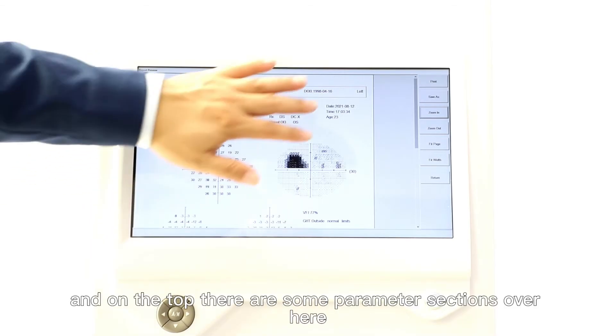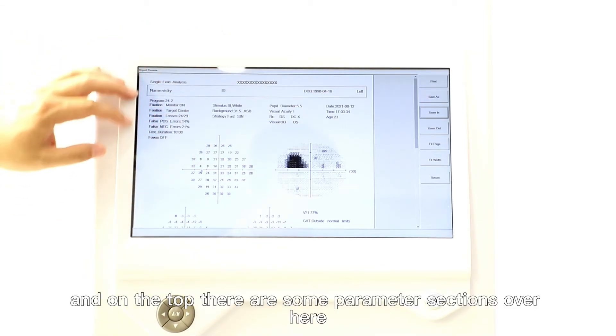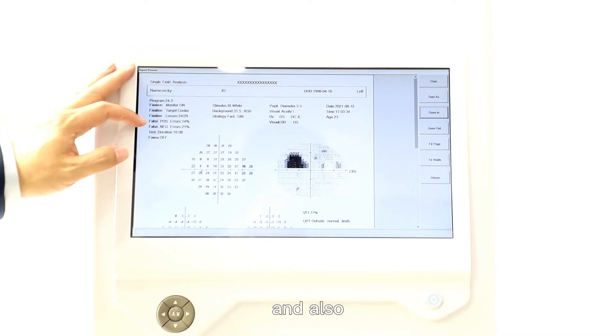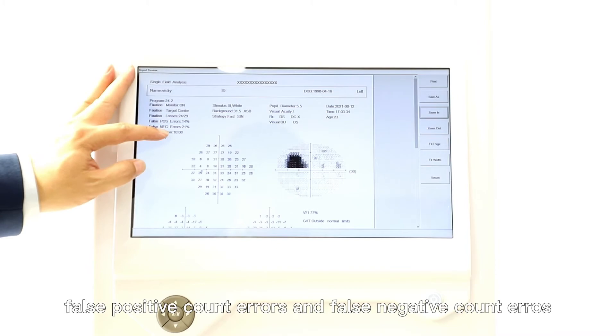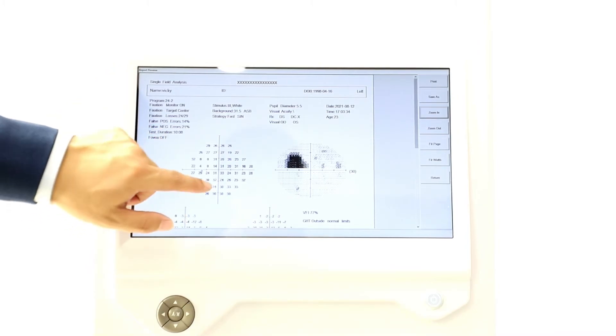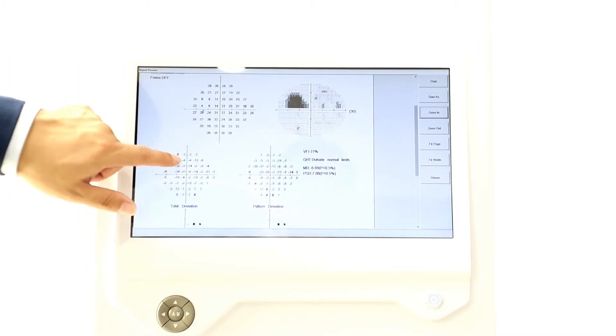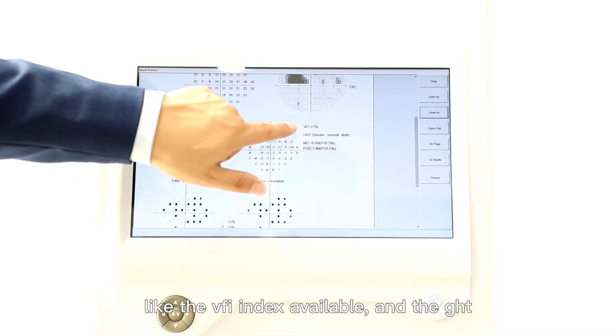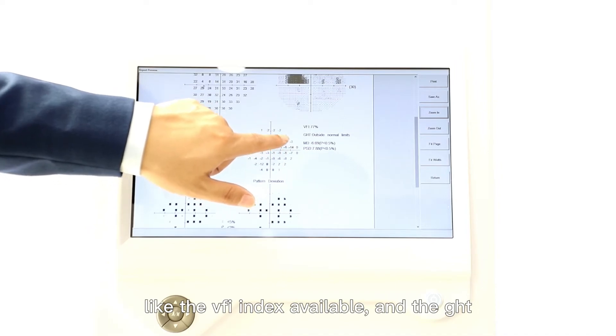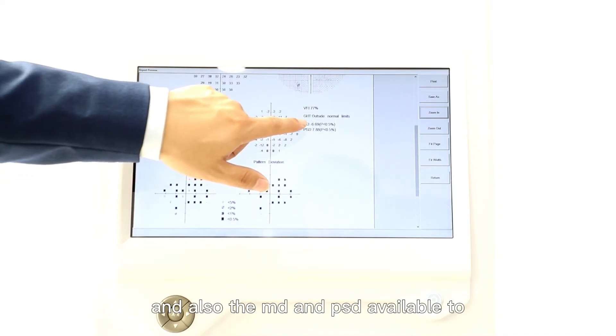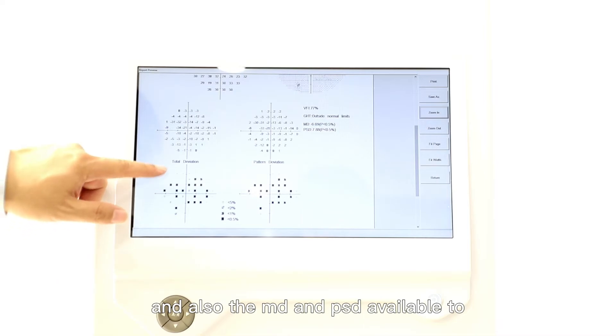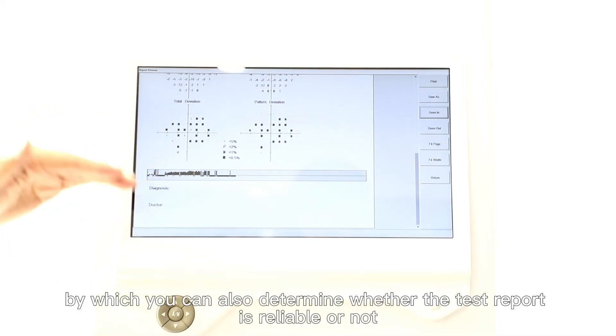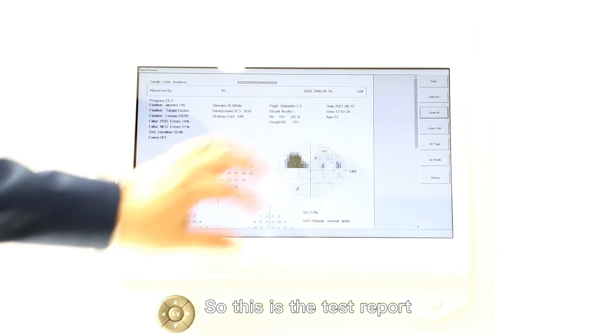For the reports, on the top there are some parameter sections over here like the fixation and also false positive count errors and the false negative count errors. You can scroll down to check the report. Over here it has the VFI index available, the GHT available, and also the MD and PSD available too. This is the gaze checking curve by which you can also determine whether the test report is reliable or not.